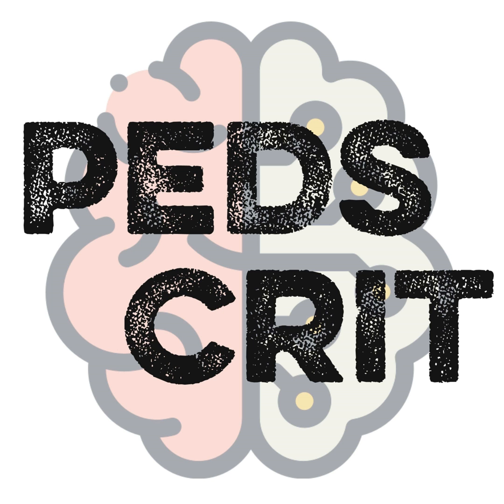The user needs to be aware of those things, and all of those require further investigation, of course, but certainly as a potential rescue mode in someone who is not an ECMO candidate or in a place where you don't have an oscillator, APRV, I think, certainly deserves consideration in the right patient. So patients with ARDS, patients who are able to spontaneously breathe. I think that's the role that APRV has in pediatric critical care right now, and certainly deserves further study in the future.